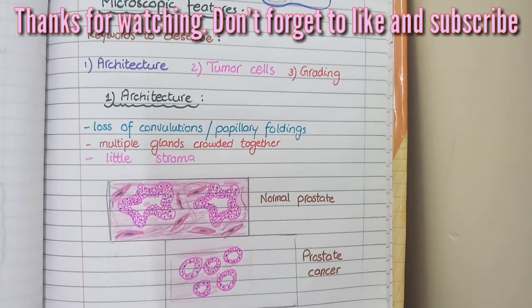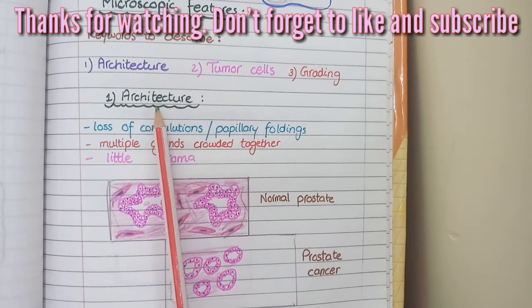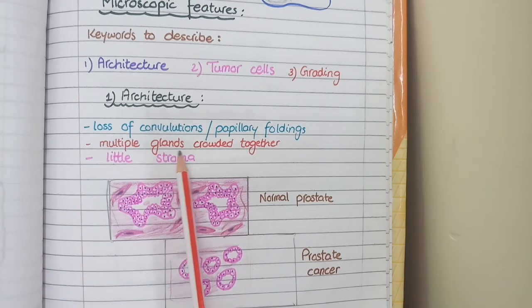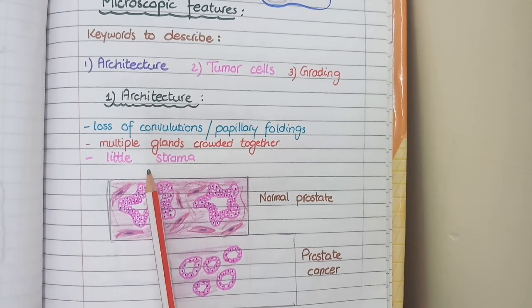Now let's revise the morphological features of prostate carcinoma. Firstly, as far as the architecture is concerned, you see loss of convolutions or papillary foldings, you see multiple glands crowded together and you see little fibromuscular stroma.